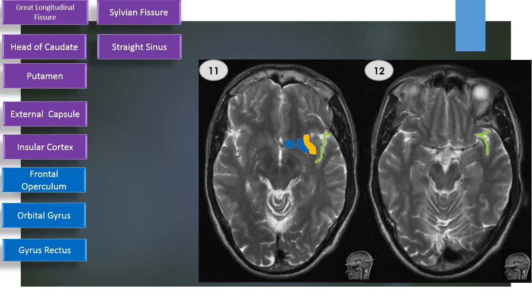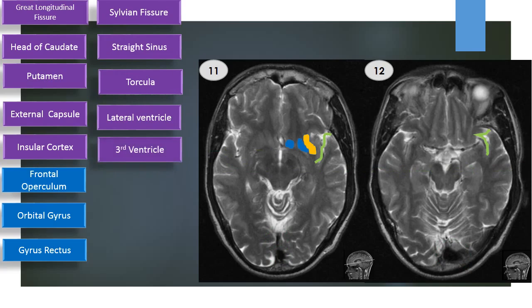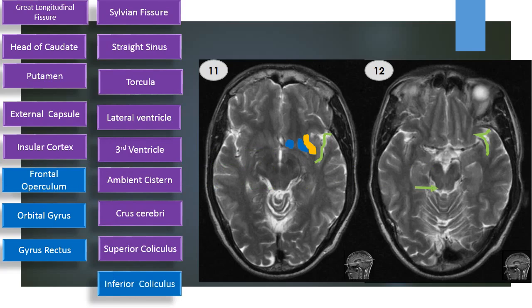Straight sinus. Torcula. Lateral ventricle. Third ventricle. Ambient cistern. Crus cerebri. Superior colliculus. Inferior colliculus.